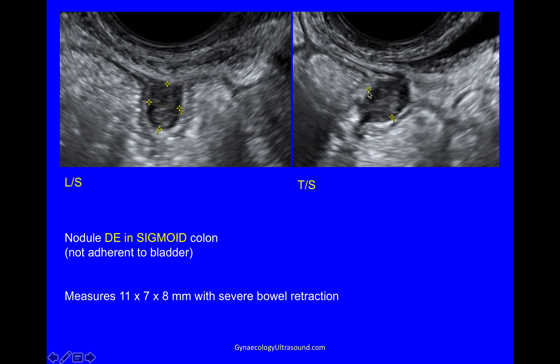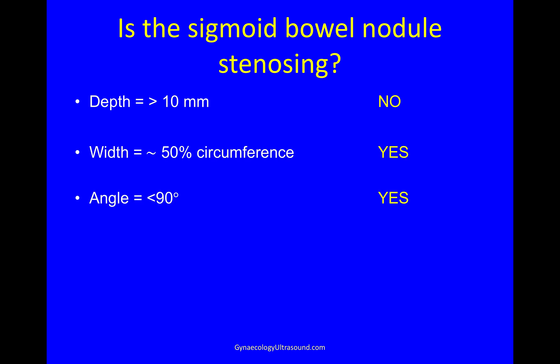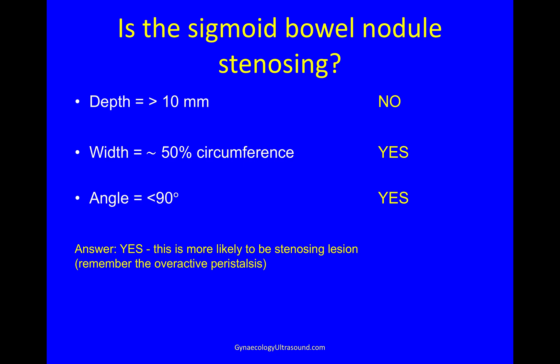If you look at the angle that the bowel makes, it is very retracted. So is it also stenosing? It's not more than 10 millimetres in depth, it does cover half the circumference, and it made a very acute angle. So I think this is quite likely to be a stenosing lesion — and especially bearing in mind we saw this very overactive peristalsis.